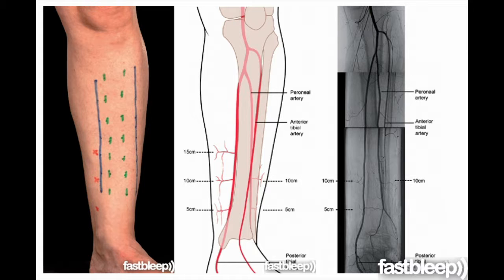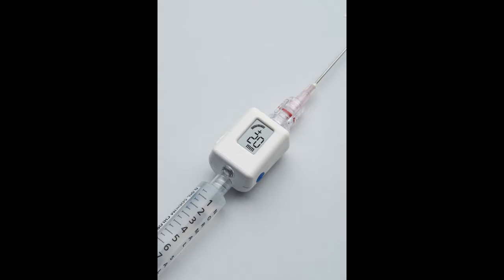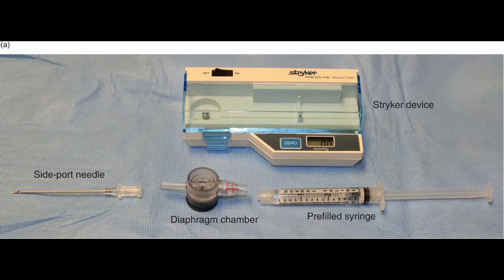Commercially available compartment pressure monitors are portable bedside tests that are straightforward to use. However, if these are unavailable, you may need to use an anaesthetic machine and arterial line monitoring equipment to measure pressure. A lack of familiarity with the setup would be awkward in a clinical setting, but potentially quite embarrassing in a viva session of your exam.